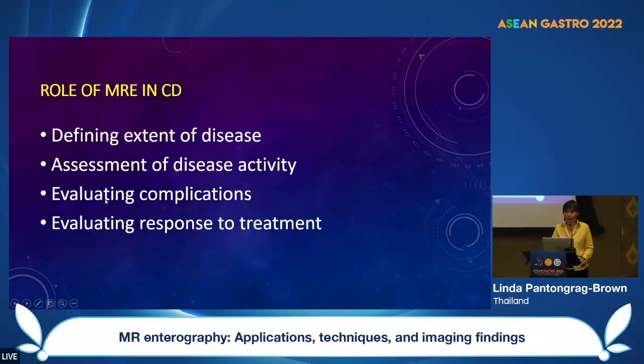What is the role of MRE in Crohn's disease? We use MRE to define the extent of the disease, to assess disease activity, and to evaluate complications and response to treatment.